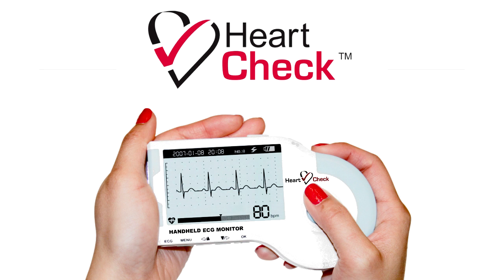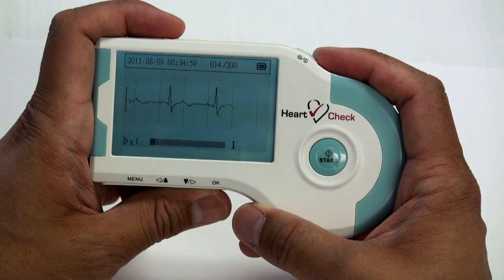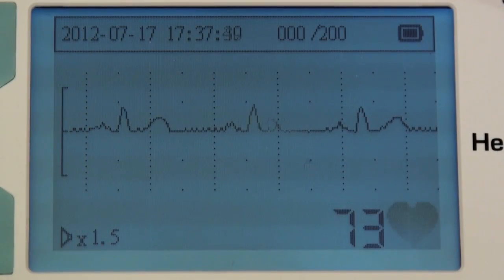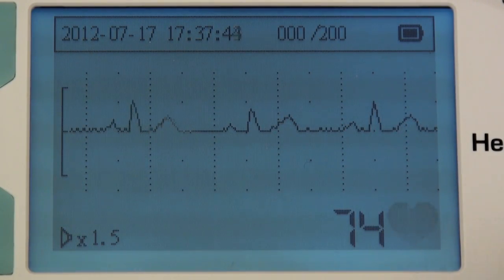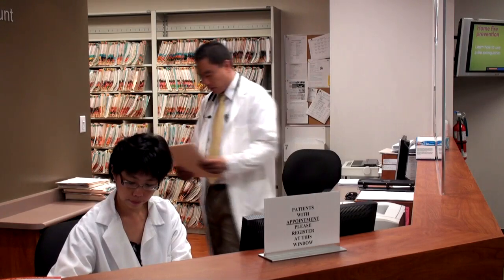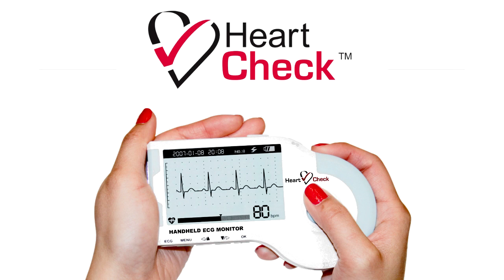Welcome to the video tutorial for the HeartCheck handheld ECG device. The FDA-cleared and Health Canada-approved HeartCheck ECG device is a portable, handheld heart rhythm monitor capable of detecting a wide range of potentially serious arrhythmias. Storing up to 200 ECGs, data can be downloaded to a computer, or sent to a physician, clinic, or ECG coordinating center for analysis. In this video, you'll learn about the features of the device, as well as how to take different types of measurements.